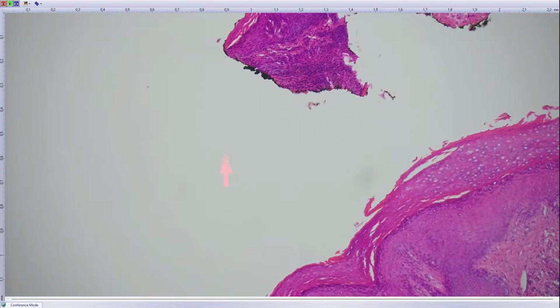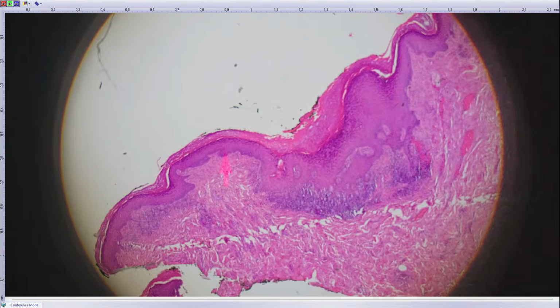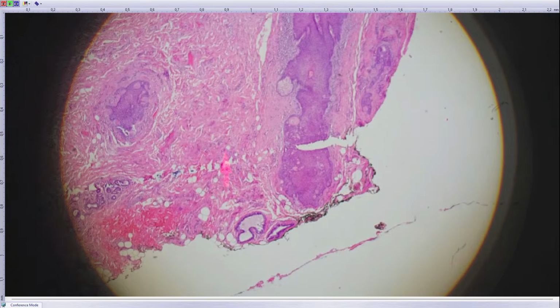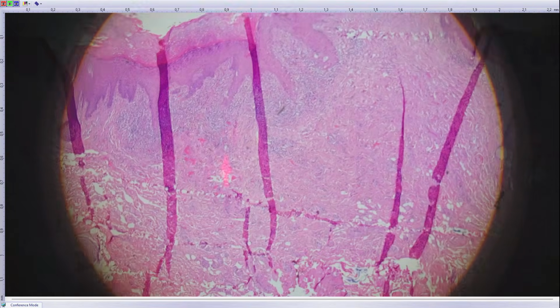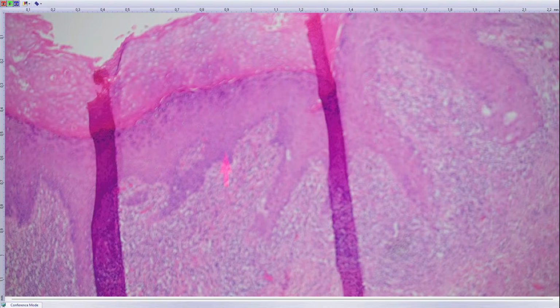In the cervix, the eosinophilia of the bulbs at the bottom is a very important sign of microinvasion. Okay. I have another slide, and again eosinophilic change with prolongation of rete ridges with loss of basal membrane.